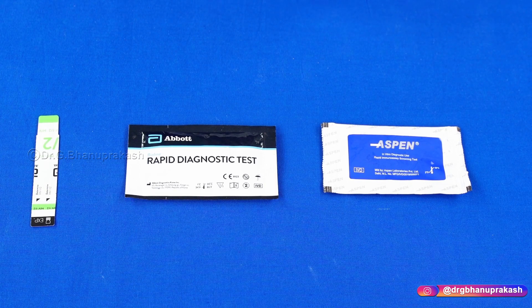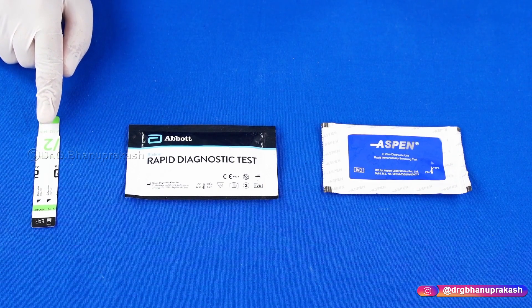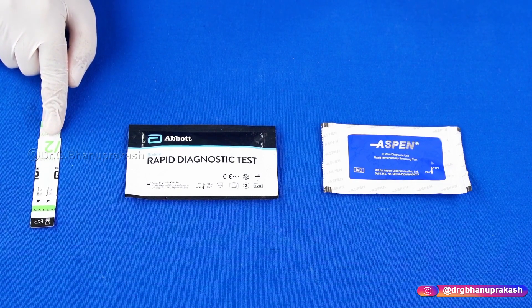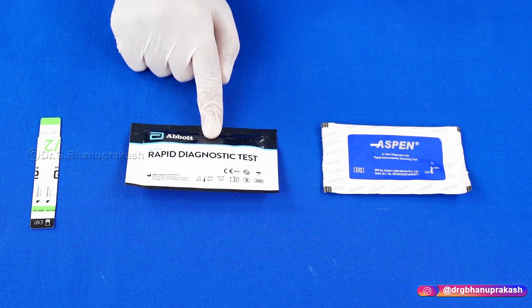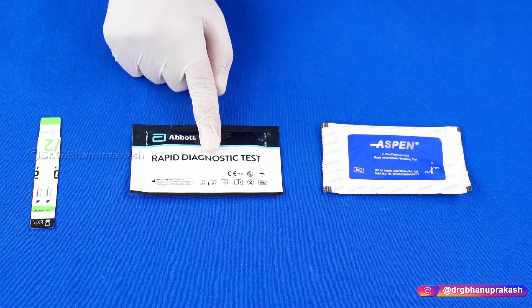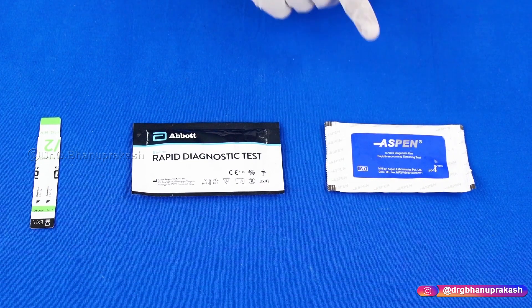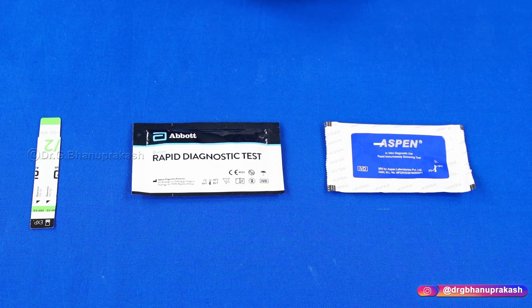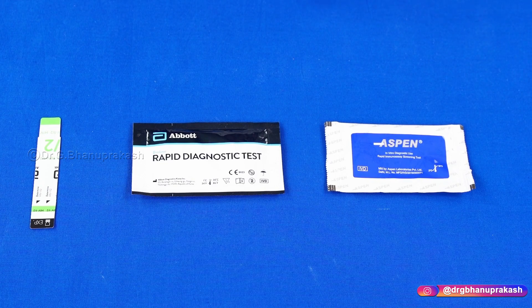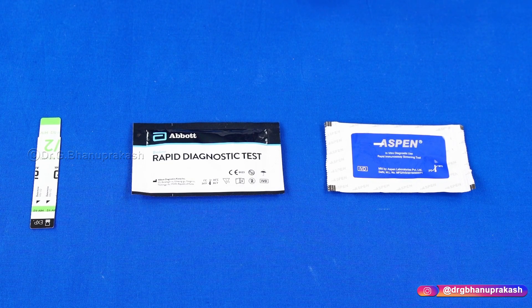So these three viral markers — HIV, HCV (Hepatitis C virus kit), and Hepatitis B virus — are the three basic rapid tests which you do before admitting the patient or before directly coming in contact with the patient's blood.